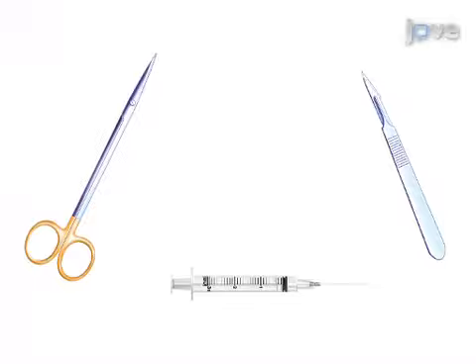The overall goal of this procedure is to produce a quantifiable, reliable, and reproducible preclinical animal model of respiratory and non-respiratory insufficiency induced by a cervical spinal cord injury. This is accomplished by first preparing the instruments and the drugs required for the procedure.